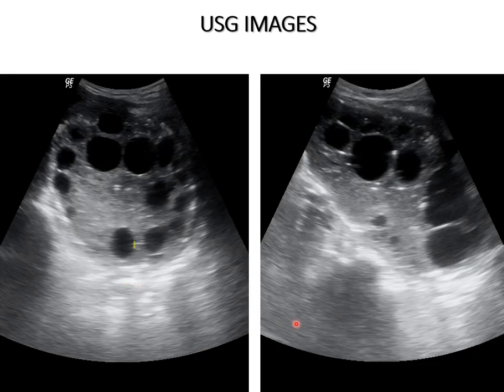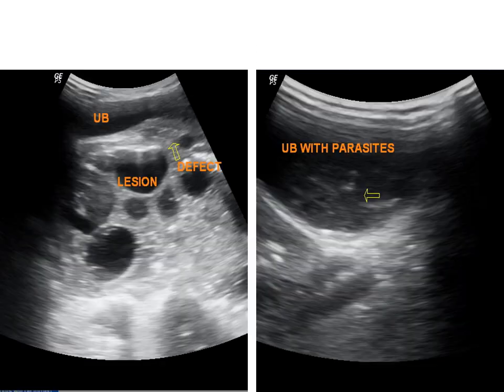On USG, a well-defined oval-shaped solid cystic lesion with daughter cysts in solid matrix with peripheral calcification was noted in the pelvic cavity. A fistulous connection was noted between the lesion and the urinary bladder. The partially distended bladder showed contents of the cyst suggesting parasites.